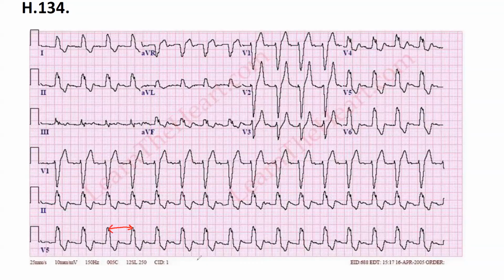The presence of P waves? Hard to say. No P waves? Something you can see here, but let's go for the chest leads in this case if you cannot see a very nice P wave. V1 can be a good area to look at. Yes, we do have P waves, for sure.